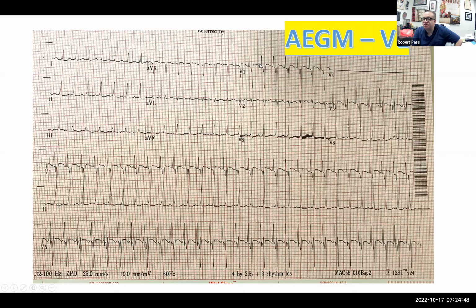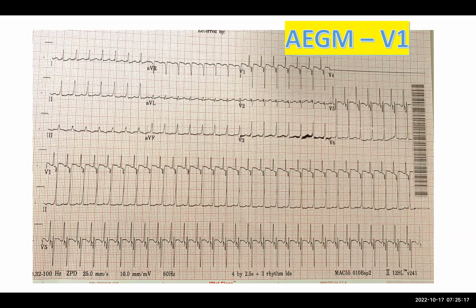So you're saying, Grace, just to restate, that there seems to be a P wave in front of every QRS, or alternatively, a P wave that is after every QRS. If this P wave is going to this QRS, it's a somewhat short PR, but it could be. This is a small infant, right?